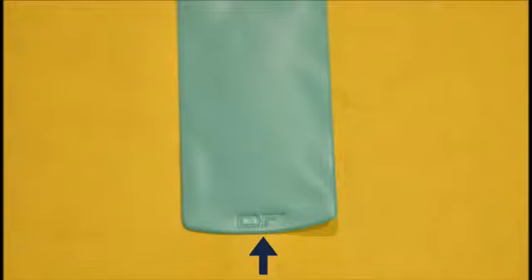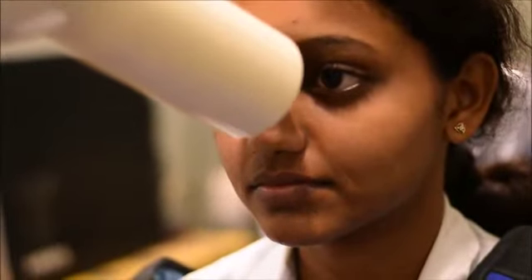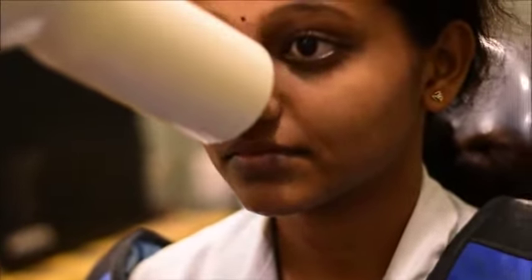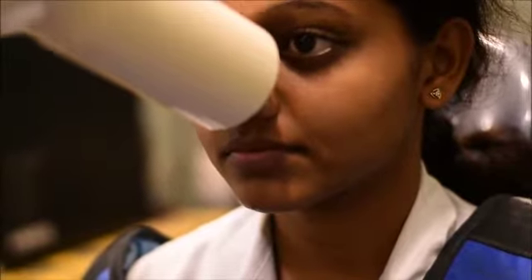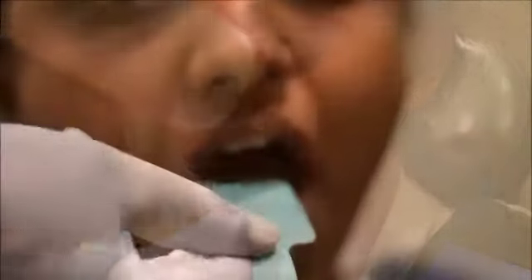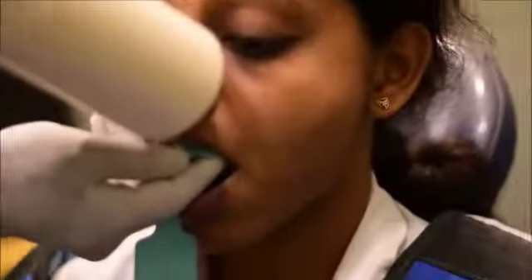Here we are showing the procedure for upper anteriors, placing the cone at the tip of the nose with an angulation of plus 40 degrees. The film is now properly placed and the exposure is made.